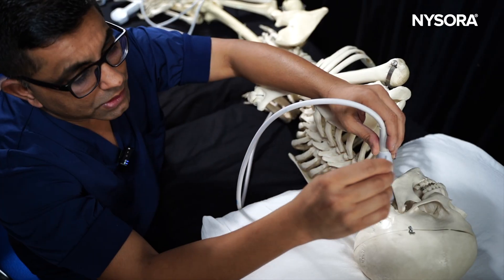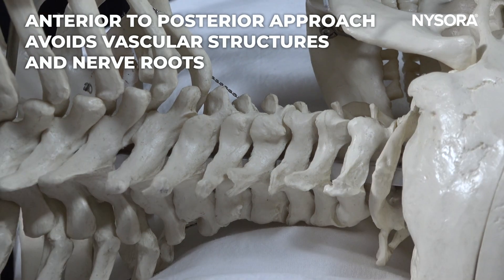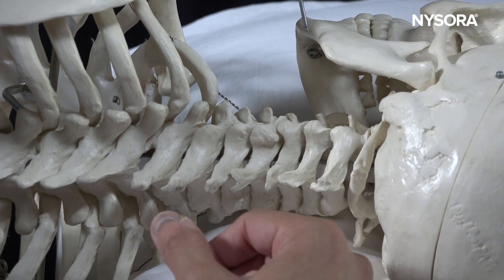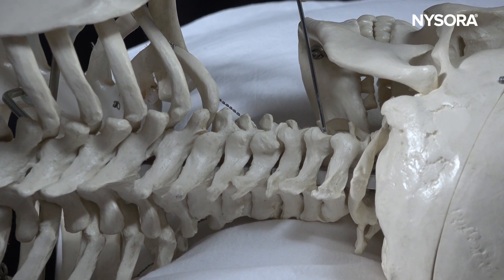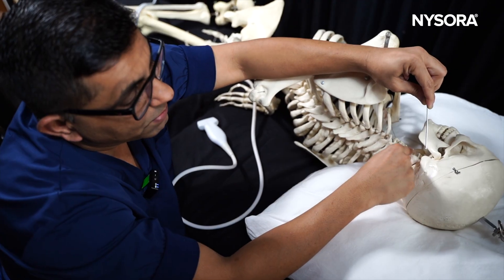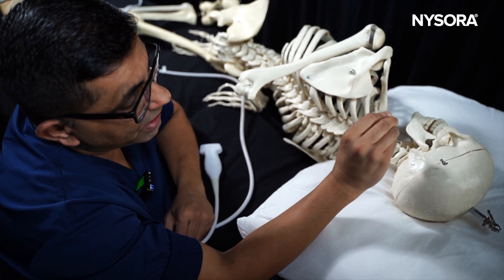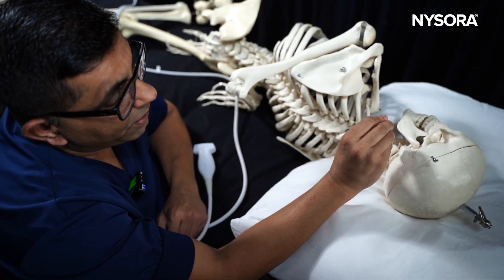The clinical pearl here is to always go from anterior to posterior. When you go from anterior to posterior, you're avoiding all the important structures including the carotid artery, vertebral artery, and nerve root, landing the needle into the trough. If you miss the bony target, you'll still be safe because you'll end up in the posterior cervical paraspinal muscles. However, if you're doing an out-of-plane technique from posterior to anterior and miss the bony target, you risk entering the vertebral artery or the nerve root.